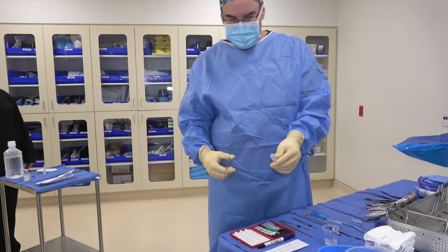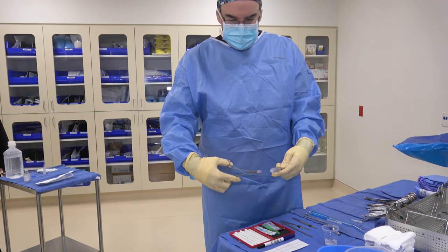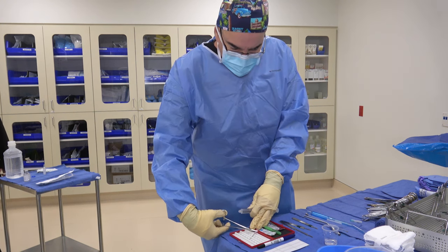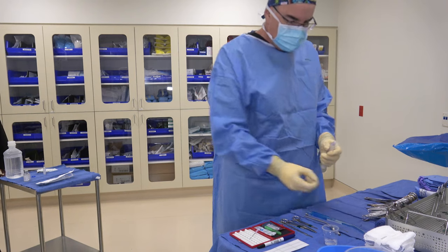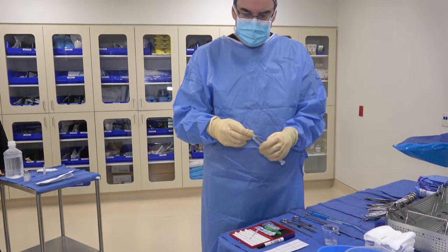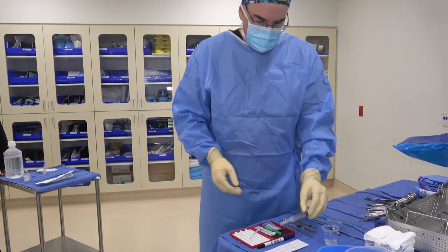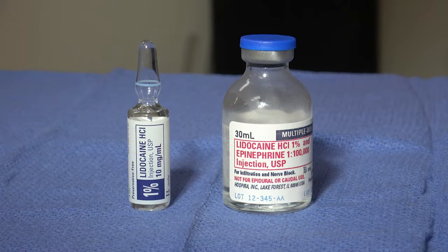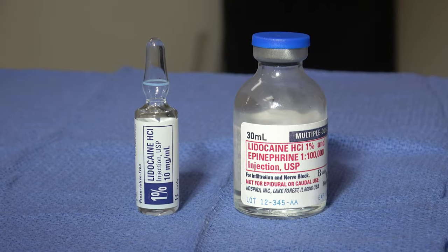Once back at your table, remove the large bore needle with a pair of needle drivers and place it in the foam of your needle counter. Then attach a small bore needle, like a 24 or 25 gauge, for injecting into the patient. We try to be nice that way.